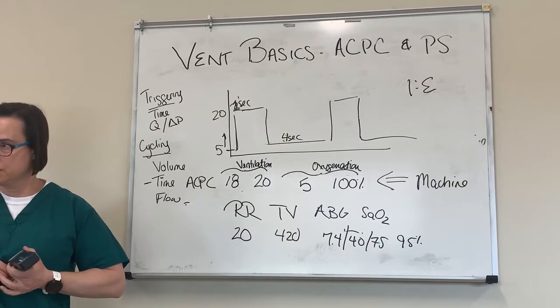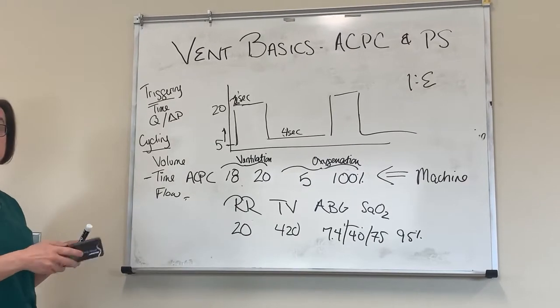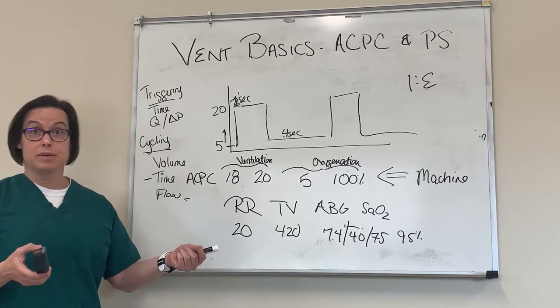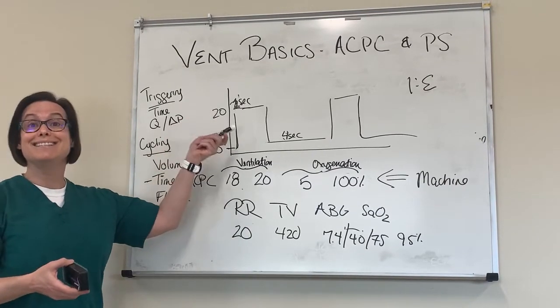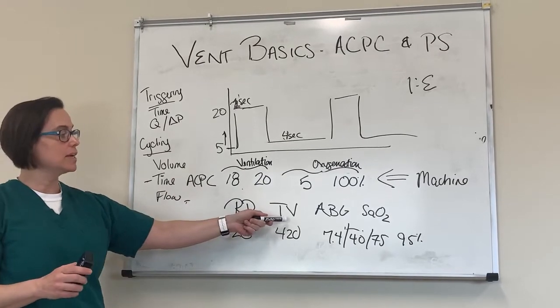Understand that. Okay. Do you have any questions about that? Are you still following the peak pressure when you're doing this? So we don't really have to follow the peak pressure anymore because the pressure we set is the peak pressure. That's the amount of pressure we're putting in. Okay, so we just have to look at that tidal volume.